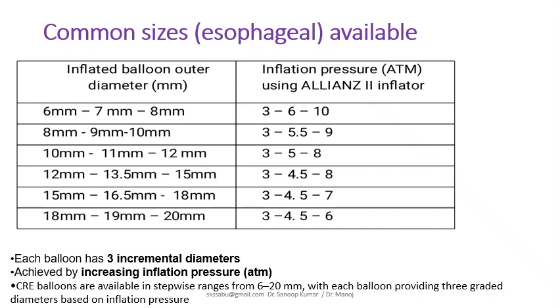The advantage is that you need not always remove it and take it out and in. For a complex esophageal stricture, you can use this balloon so that at multiple levels you can use multiple diameters.